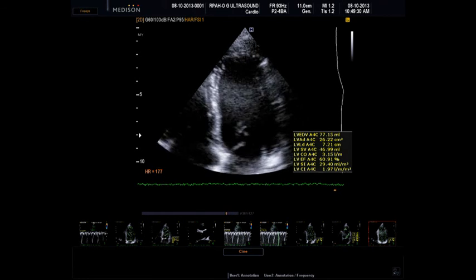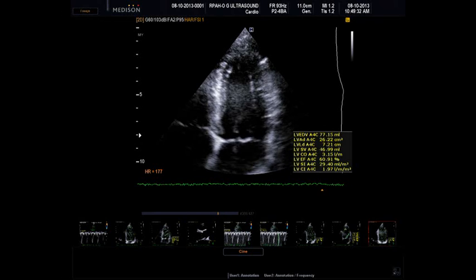And who should do this examination? Should it be obstetricians or cardiologists or internal medicine specialists, sonographers? Well, I think as long as you have the right training, I don't have a problem with people's scope of practice crossing into other areas, but it depends what you're using it for.